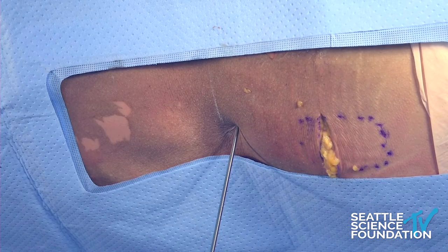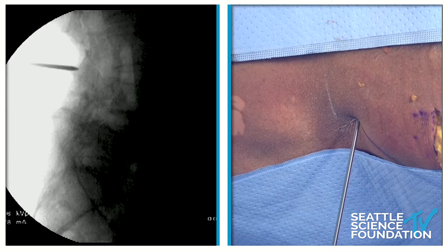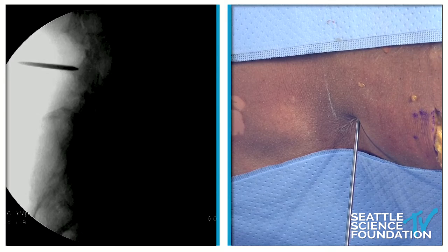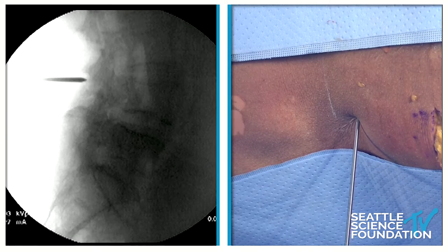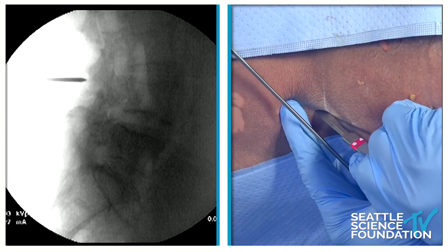So we're at 3.4, and the spinous processes always slope posterior — they go from superior to inferior. We want to get the spinous processes visualized right there, so we can see that this is exactly our start point. We're right between L3 and L4 spinous process.